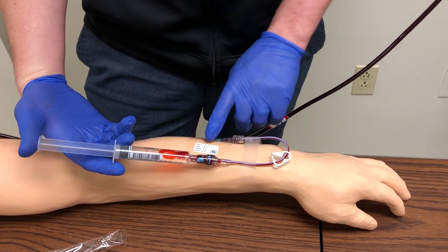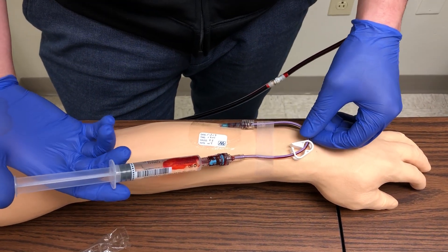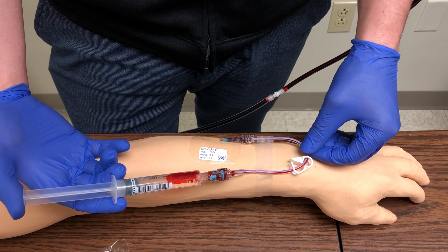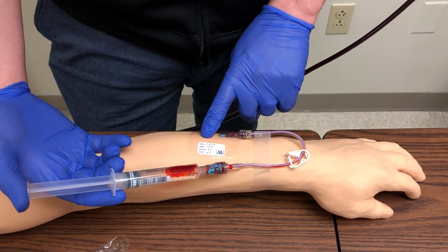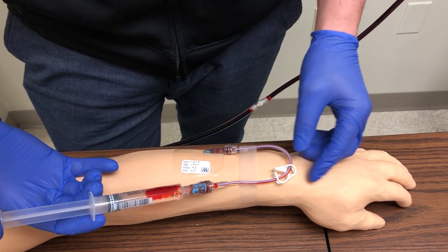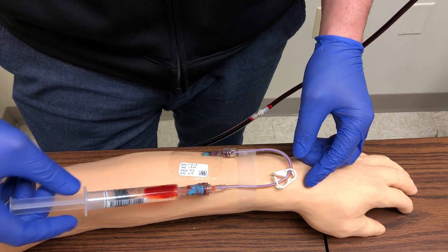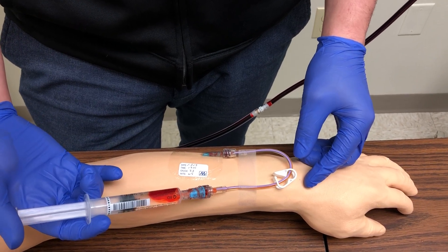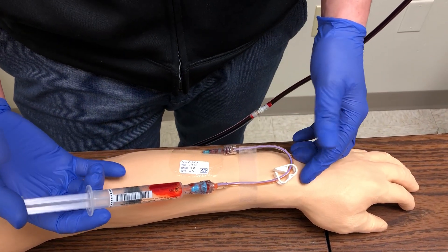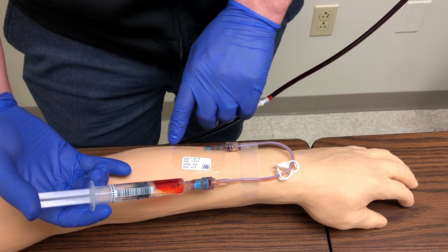Once we get blood return, we're going to inspect the IV site looking for any redness or leaking. Then slowly inject the medication — we don't want to do this too quickly and cause discomfort. As I'm slowly injecting, I'm looking around the IV site for any infiltration, signs of discomfort, or leaking. Some patient education: the saline solution may feel cold since it's at room temperature while your veins are body temperature, but we just want to make sure there's no pain or burning at the site.